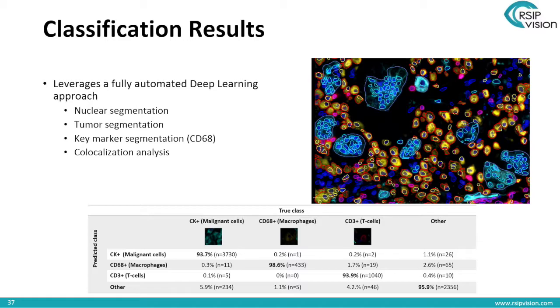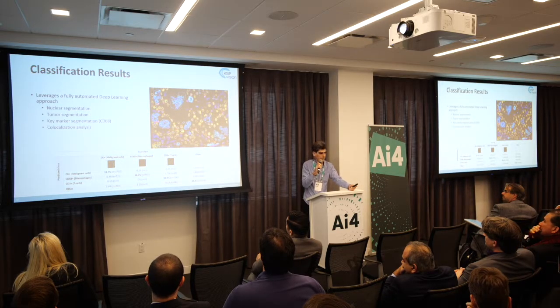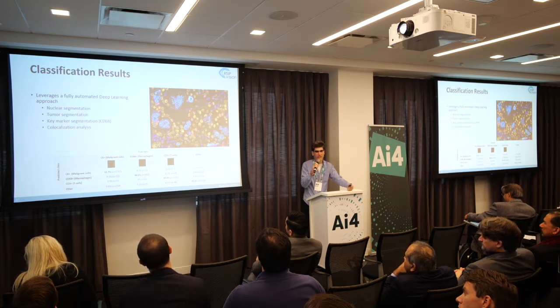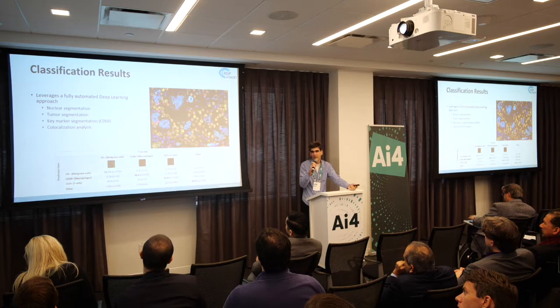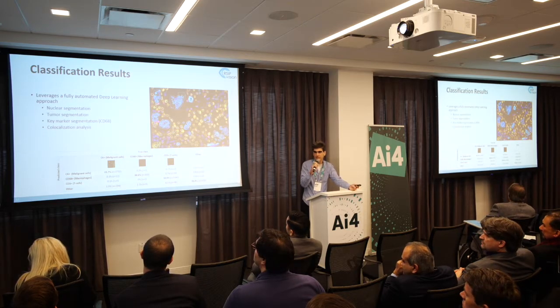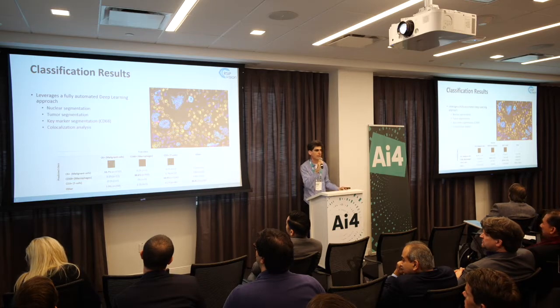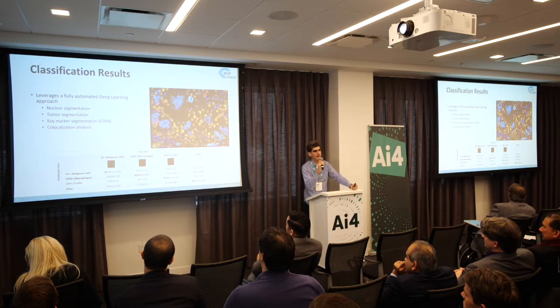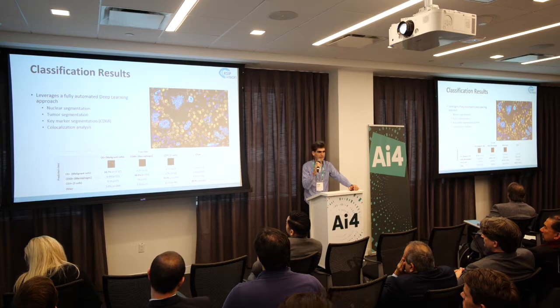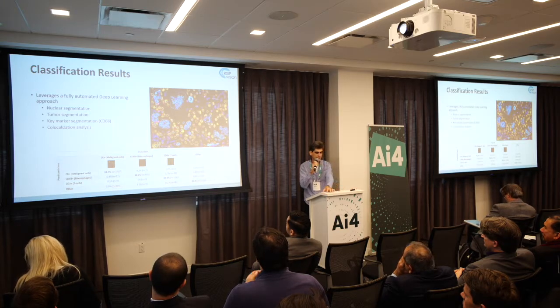You don't need to annotate nearly that much to get a good result, and you can test it on all the others that you haven't annotated yourself. You can pull up test sets to your heart's desire to verify and re-verify this algorithm. And the accuracy is 94 to 98%, depending on the cell type, including other, which is in many cases challenging. In general in AI and also in digital pathology, sometimes if you have your other class, then you're going to need to start breaking it down.